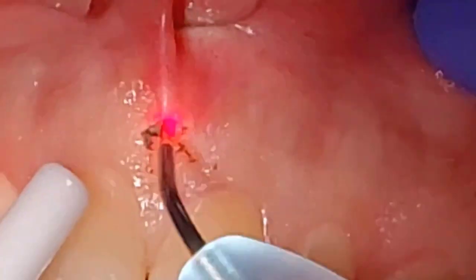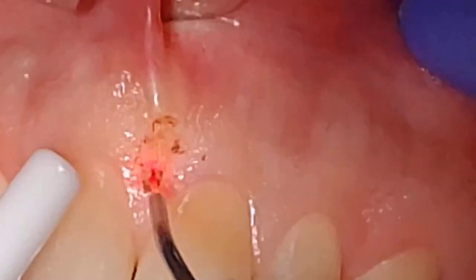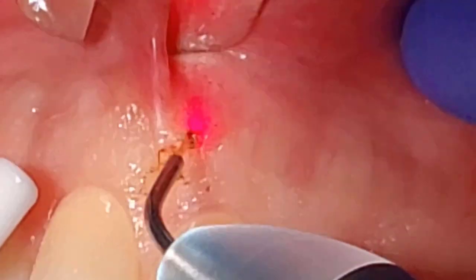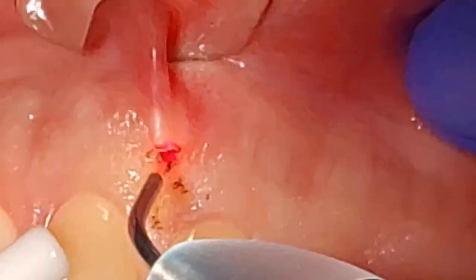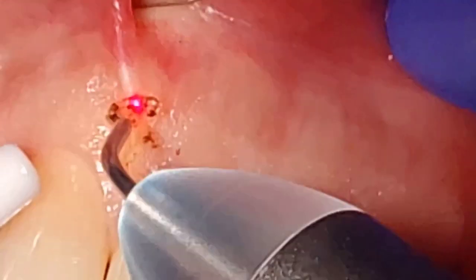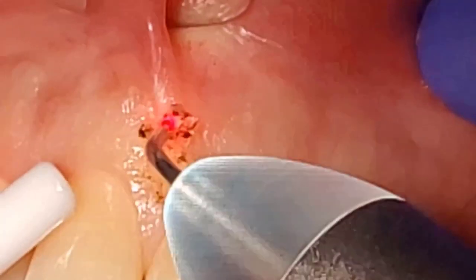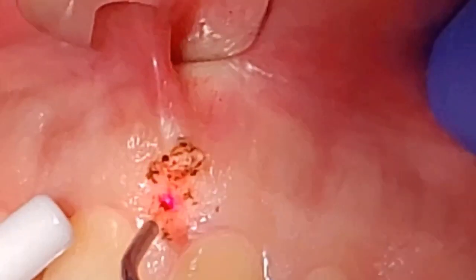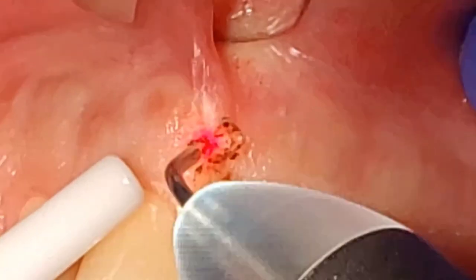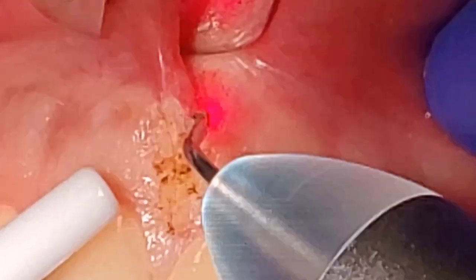Now, if we get a deep vessel, we may get a little bit of bleeding, but initially, right here, nothing. I'm going to continue to dissect the frenum as we go through. Careful not to shine that laser off the groove director, because that groove director can reflect. We don't want the energy to reflect back really to the person who's shooting this video.